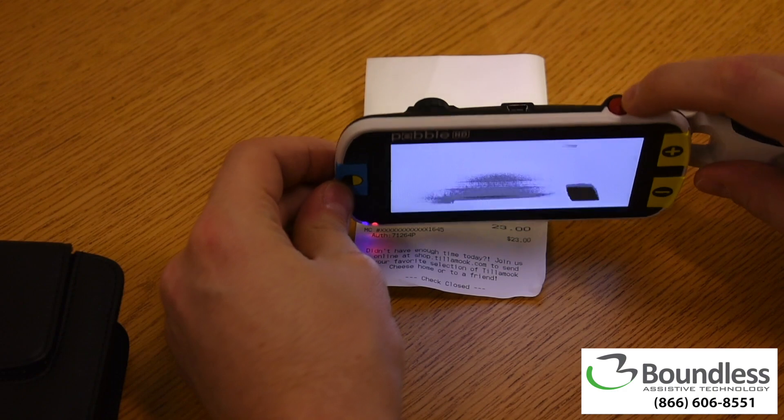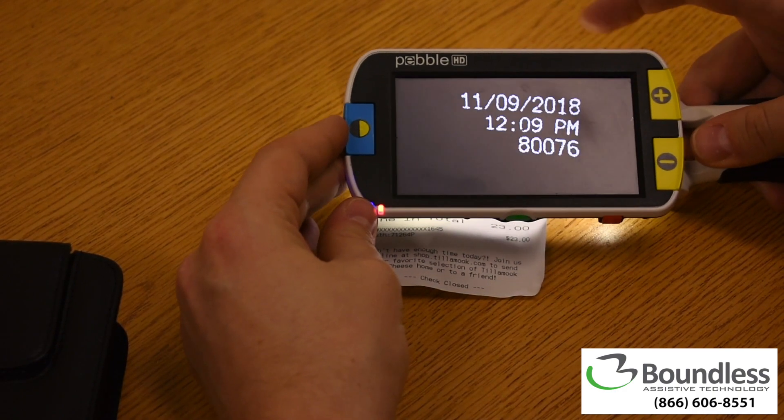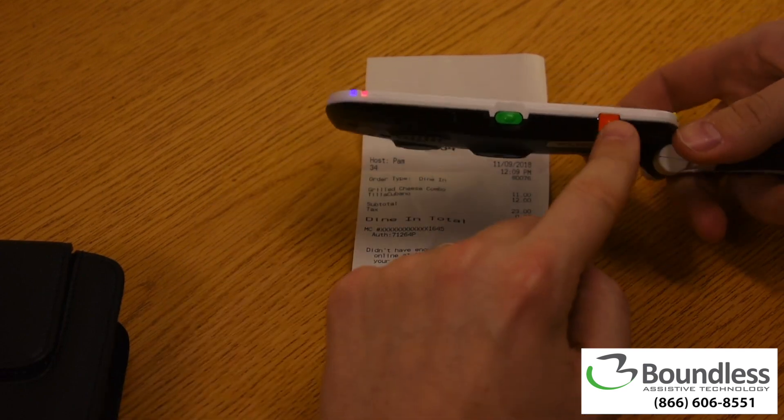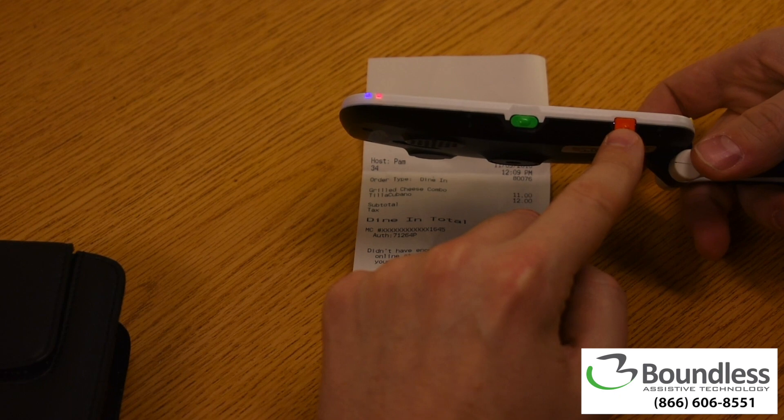At the top edge, we have a red button that we can use to capture a still image. This orange button here on the right hand side of the front edge would allow us to access saved images.